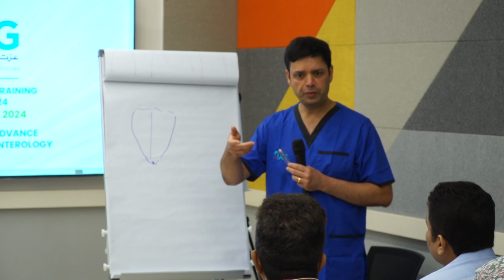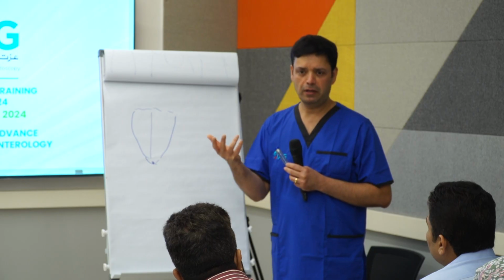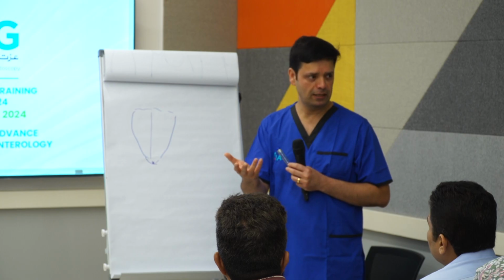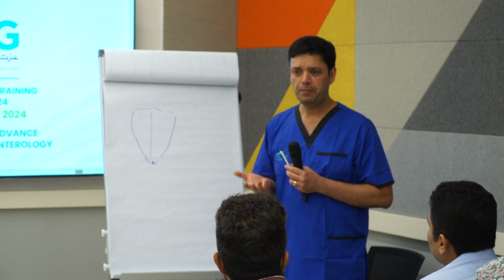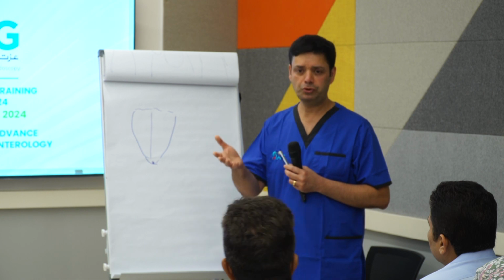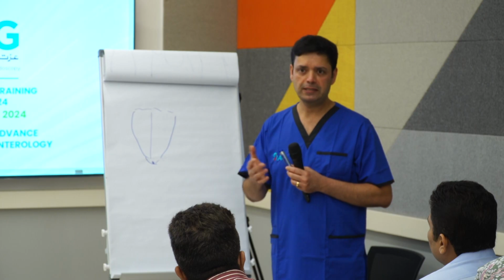But if you're not very sure, then putting a plastic rather than a metal stent is what we would advocate. In a sense, a plastic stent is good enough in those situations in your centers, cost-wise. But in Western practice, we have moved towards fully covered metal stenting when we are not sure what we are dealing with at that time. But plastic stents are good enough.